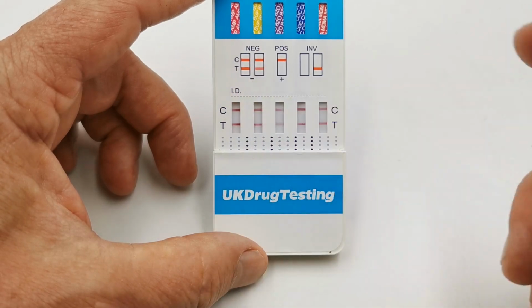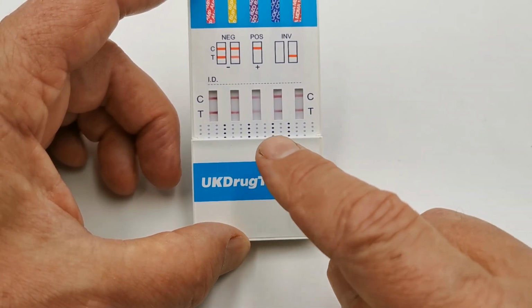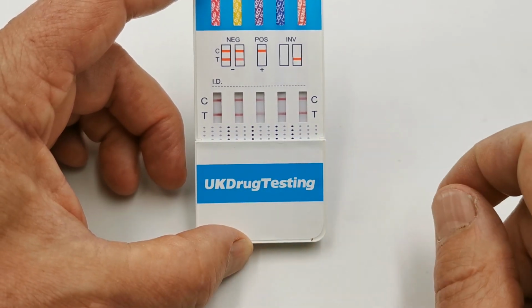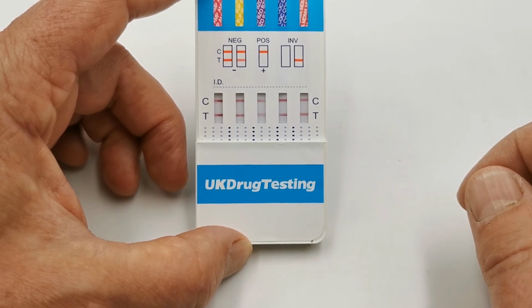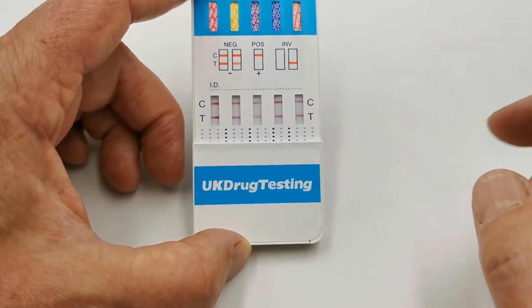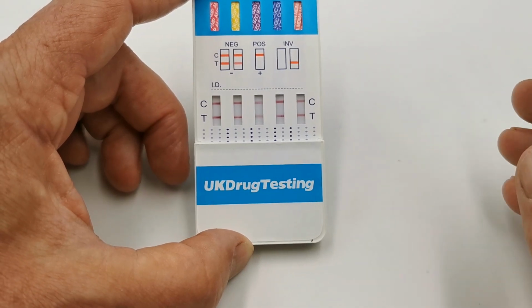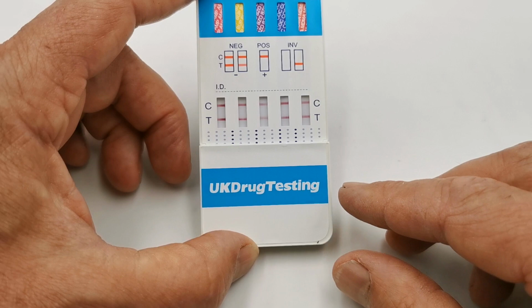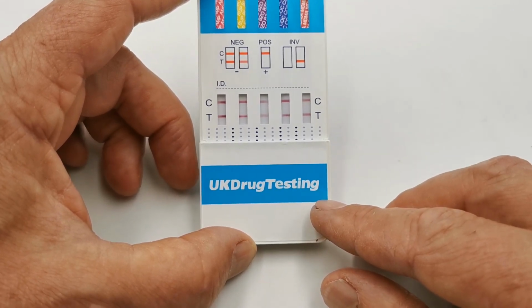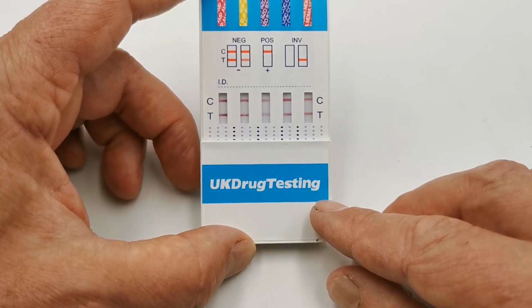The example here given on the panel does show that there will be some variance in the test line colour density, and you can see it here between the benzodiazepines and the buprenorphine test. A dark test line on bup, a faint test line and a fainter control line also on the benzodiazepines. These will vary. Do not try and infer any significance of the colour density of your test line or its thickness. As long as there is a test line showing with a control line at the correct read time, the test must be interpreted as fully negative.